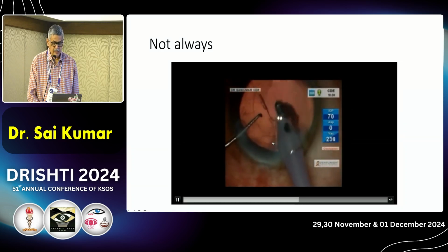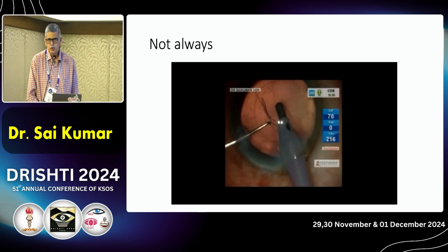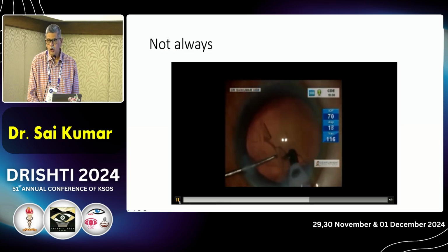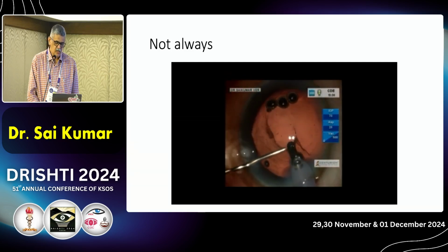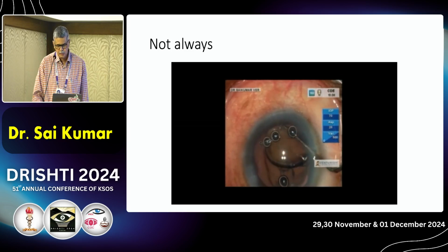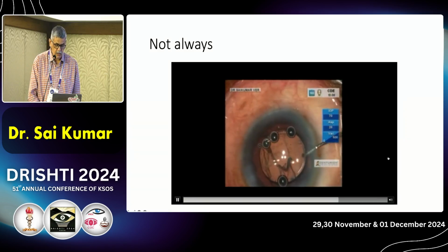Till this point, there is no vitreous. So that is something that I want to emphasize, the chamber maintenance. The moment you see a rent, don't come out. Always remain there. There is a significant chance, I am not saying percentages, but a significant chance that you have an intact anterior hyaloid at the end of your surgery, and you can still get away by not doing a vitrectomy in these situations. So before you come out, always fill the chamber with a dispersive viscoelastic, and then again a 3-piece lens goes in and is captured.